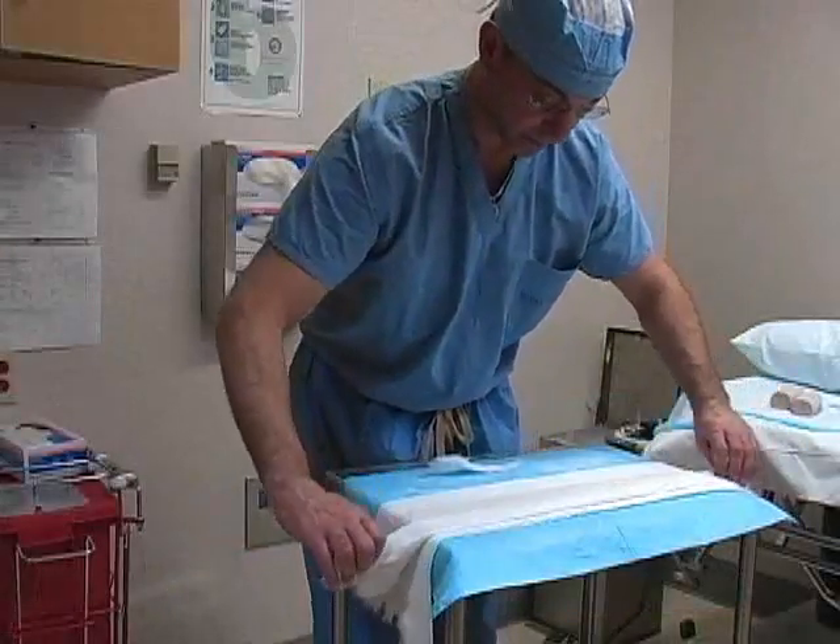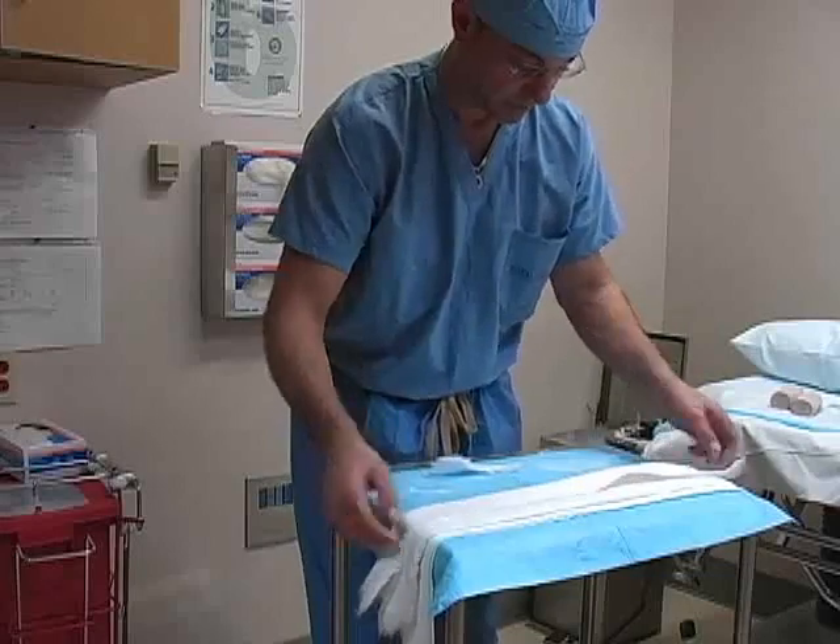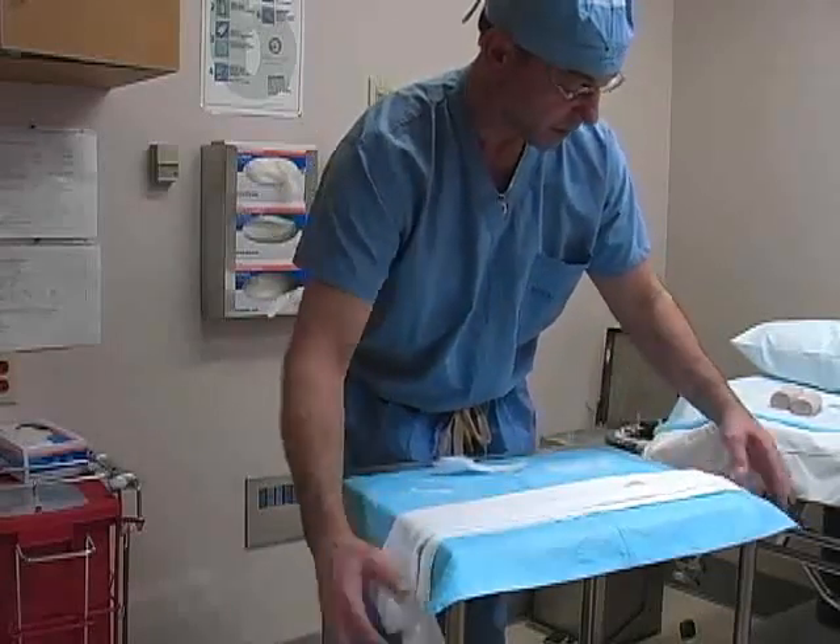Lay the plaster down onto the cast padding and smooth it with the palms of your hands. Place another layer of webril over the top of the plaster, which will prevent it from sticking to the elastic bandage.